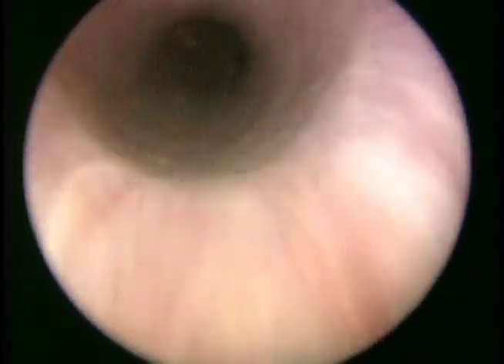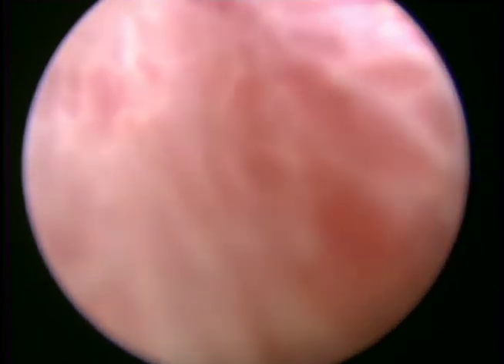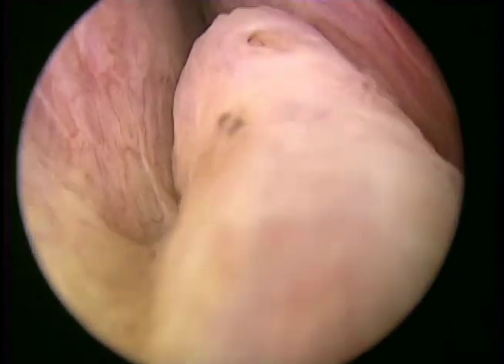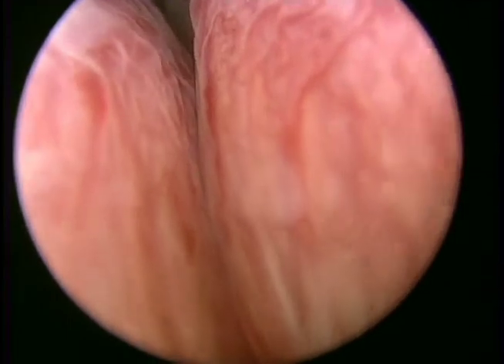We begin the procedure by doing a standard atraumatic entry of our laser resectoscope sheath. In this instance, we use the Storz 23 French laser bridge under direct vision to ensure an atraumatic entry into the bladder. Once through the urinary sphincter, we pass the verum montanum followed by both lobes of the prostate. Here we see a more asymmetric left lateral lobe with some entry and projection into the bladder.